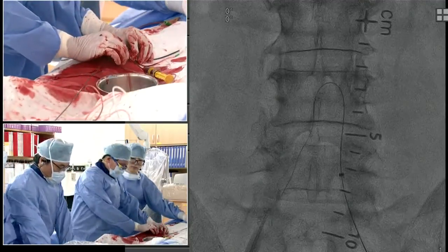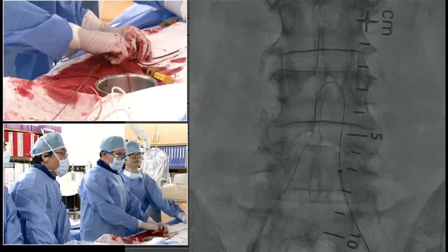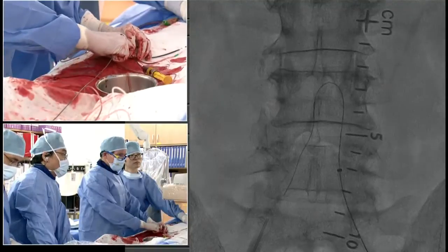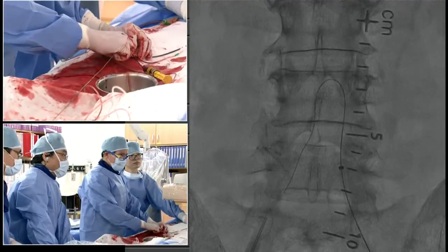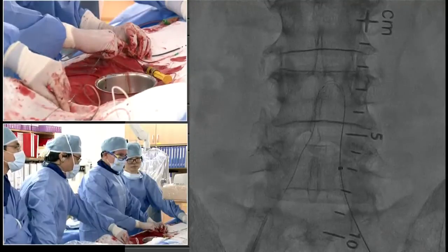Okay, final decision in room 2, with Drs. Singh and Yu and Hong. That's great. I think we're stuck in the plaque, which is good. I like that. Okay, you're going to have to give me a little negative probably on that wire.